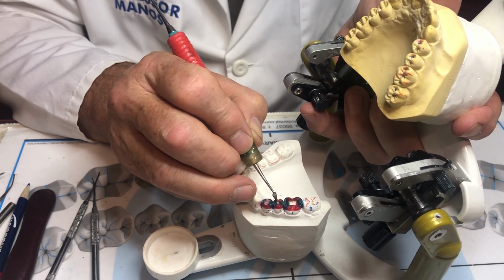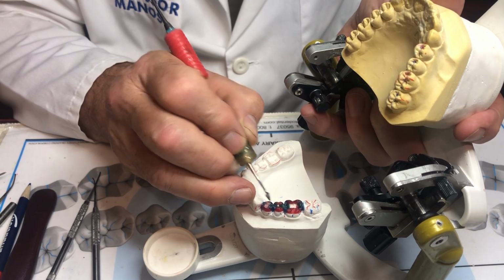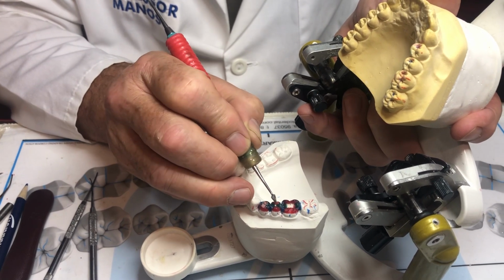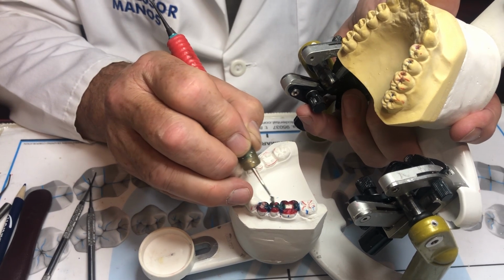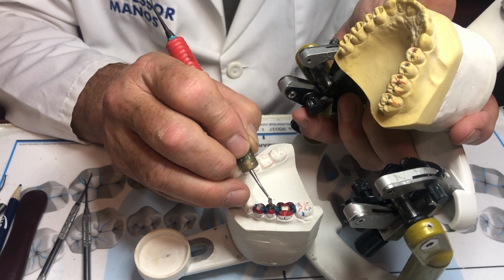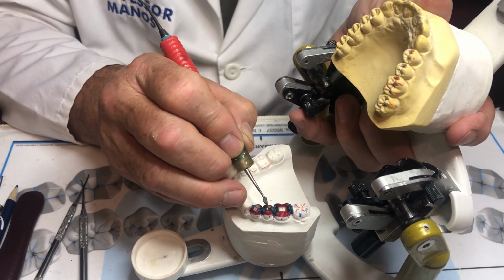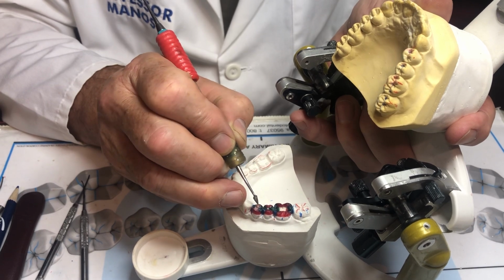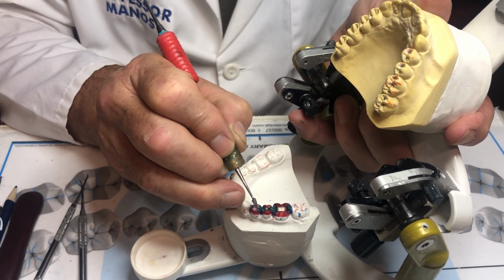And the central groove is shaped like a letter Y. So you're not going straight across. On this one, it's relatively straight across. But on the second one, it doesn't go straight across mesial, it goes down. So when you're carving it, you'll carve down, down, down, and it'll be shaped actually like the letter Y. So on this one, totally different, not the same teeth.